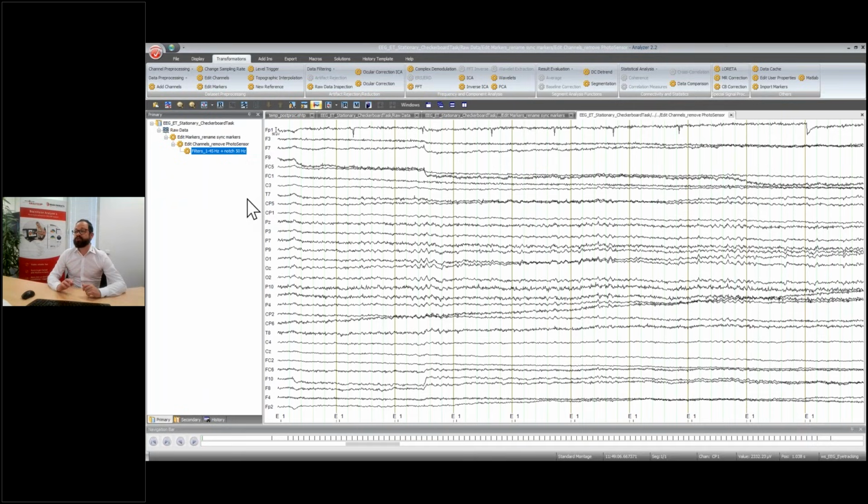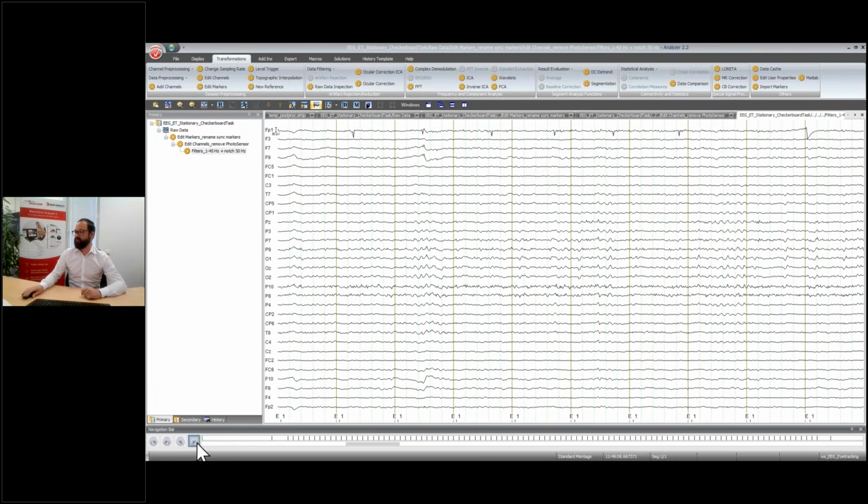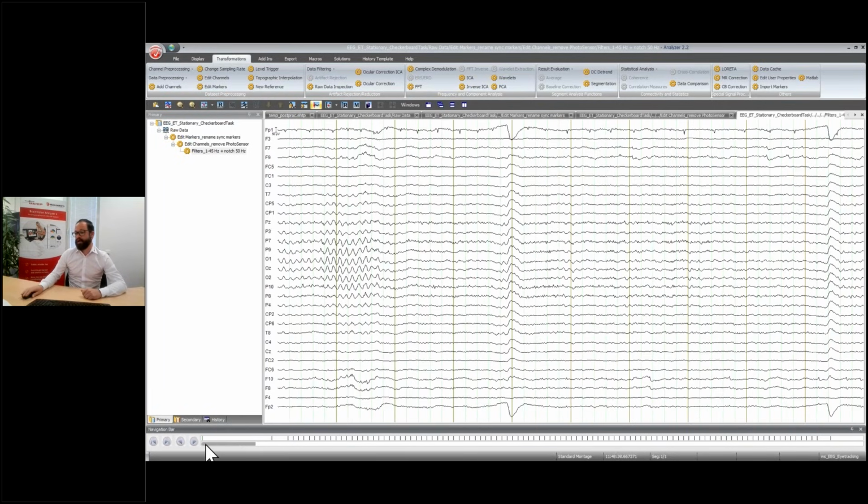These are the parameters that we have adopted from the Sandman paper that Laura mentioned earlier, which is the basis of our task today. If I double click on this node, I can see right away that the data now looks very clean. So this is where I would now like to start including my eye tracking data.